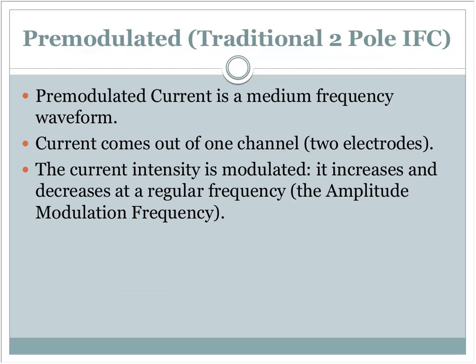Premodulated, this is a traditional two-pole, and it says interferential current. Just described that way because it delivers the same type of current, but only between two poles. So you surround, or basically monkey in the middle, you know, electrode on either side of the intended target that you're treating, and the current will go between those two electrodes. Keep in mind that the closer you have the electrodes, the more current is going to go through the superficial dermal layers versus further apart where it will actually arc downward beneath the dermal layers and into the muscle tissue.